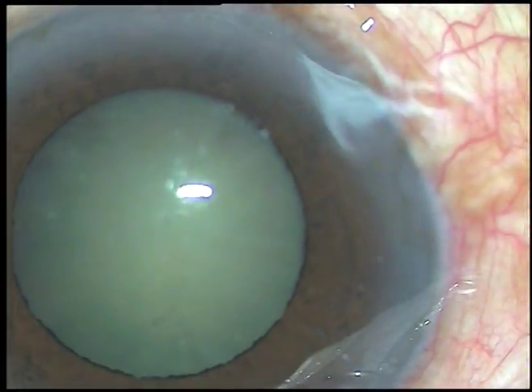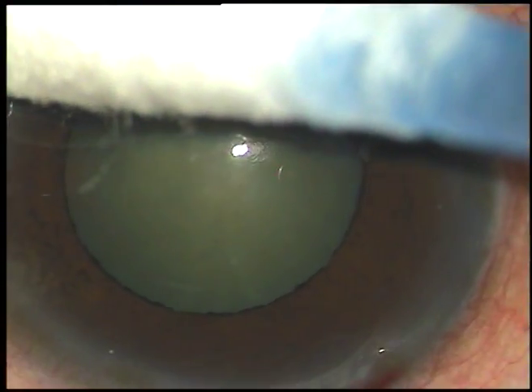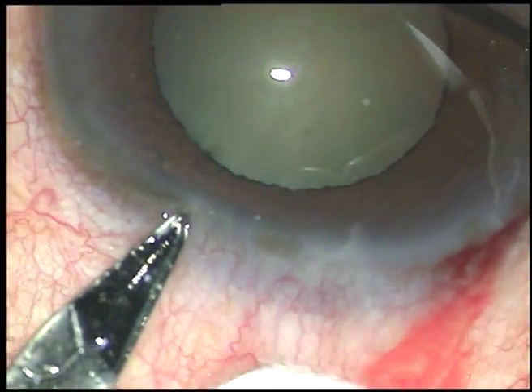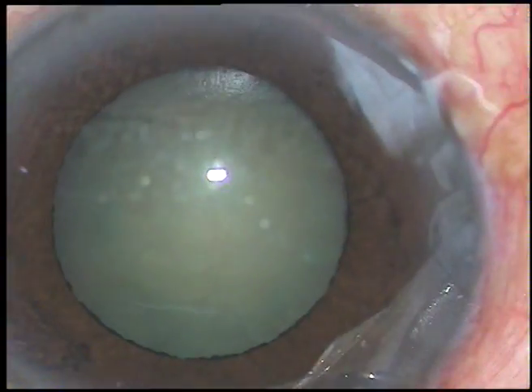This is the main incision, and now a side port is being made about 2 o'clock hours away from the main incision on the left side for introduction of the chopper.